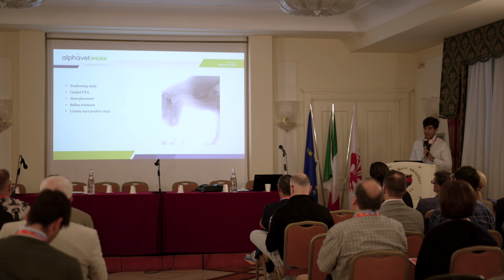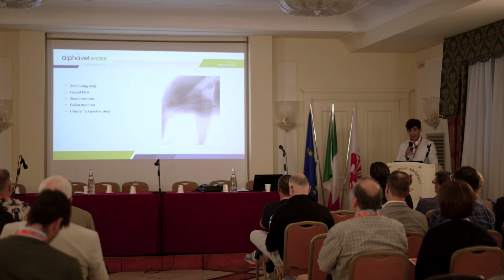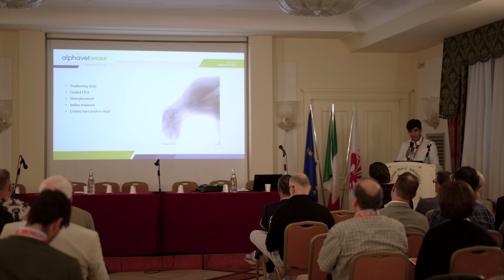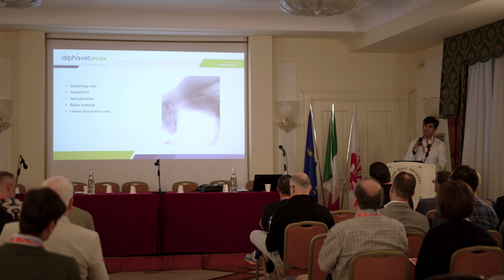You can do a swallowing study. Easy to understand that we need a fluoroscopy to do swallowing study, and it's very common that they demand a swallowing study in clinical cases. But what I prefer is the guided FNA. So you do the study, you see the hepatic lesion, you go guided, you are secure, and you can have a standard protocols with your team.